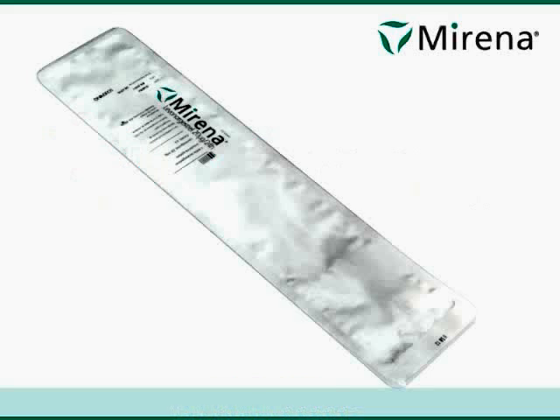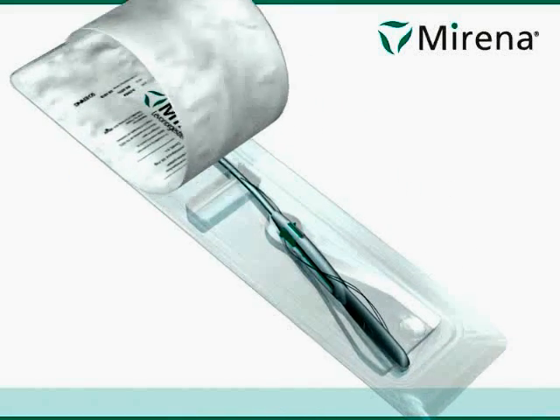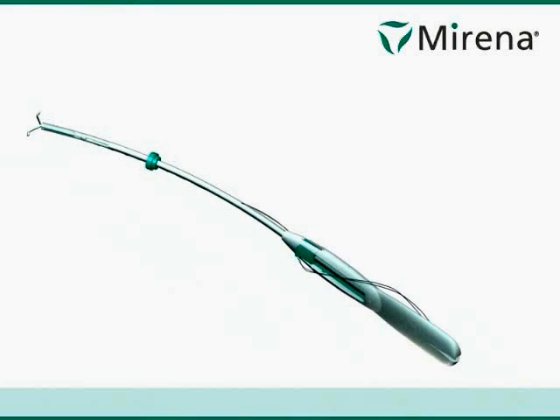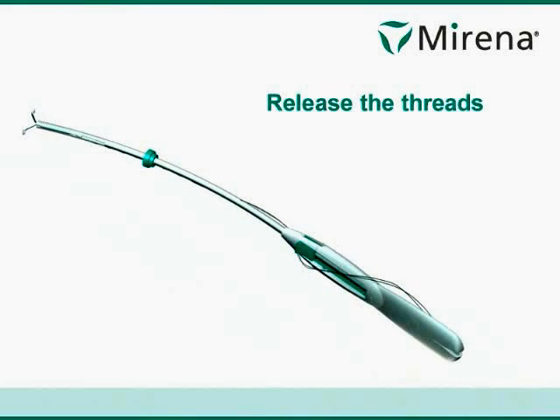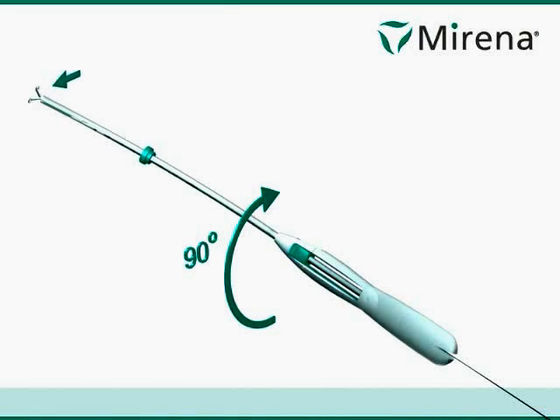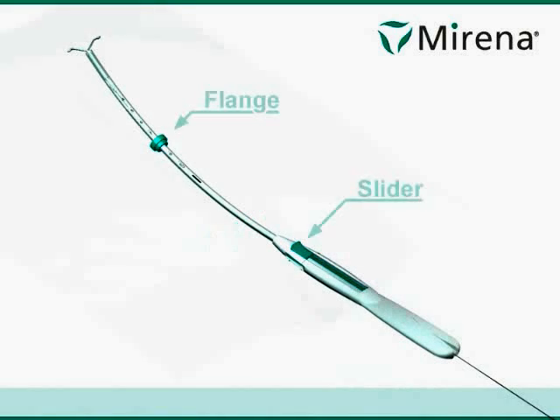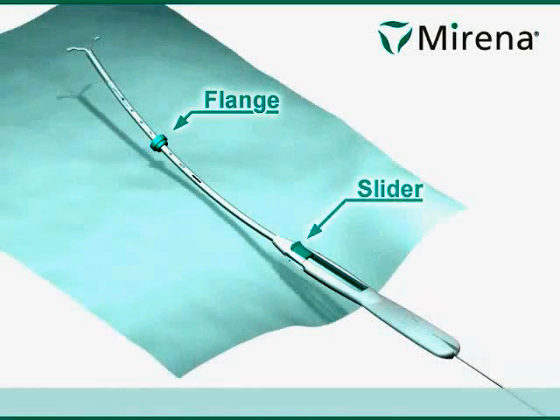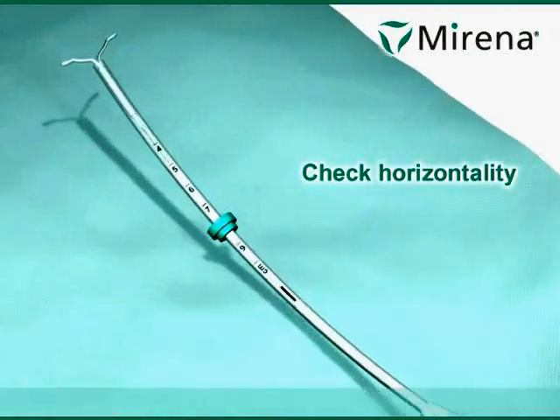Mirena insertion: release the threads, rotate 90 degrees, flange slider, check horizontality.